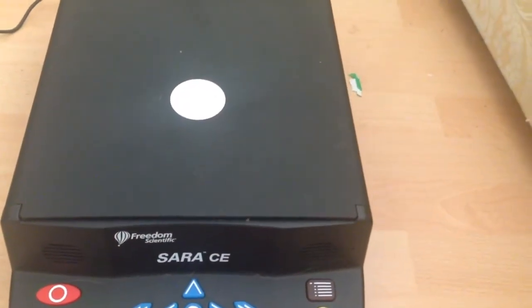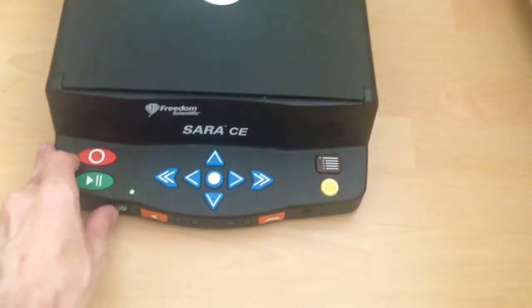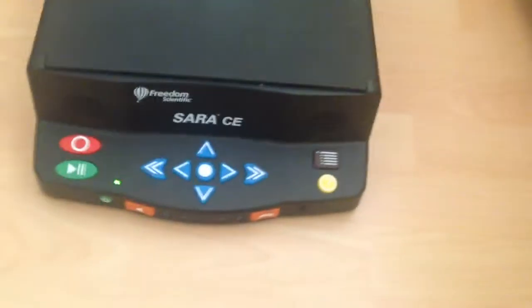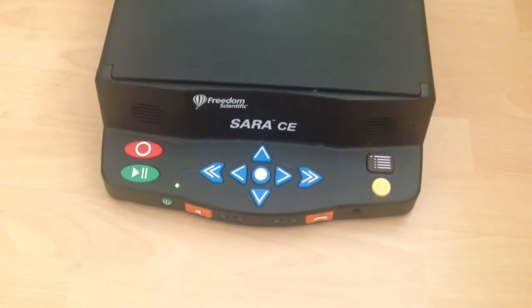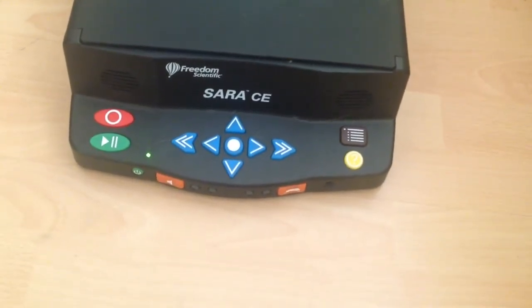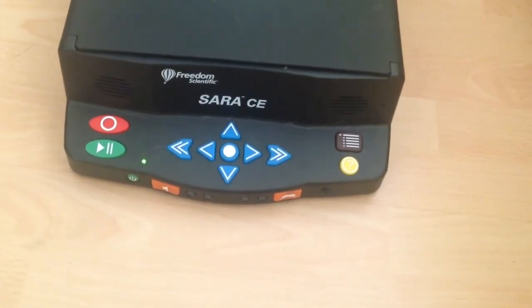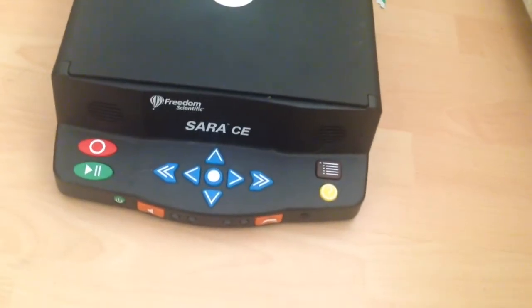Without further ado, let's shut it down. Press the power button and it says: press the power button again to power down, press the down arrow to put SARA to sleep, or press any other key to cancel. Press the power button again — and there she goes. Hope you guys have enjoyed, and I'll speak to you all very soon.